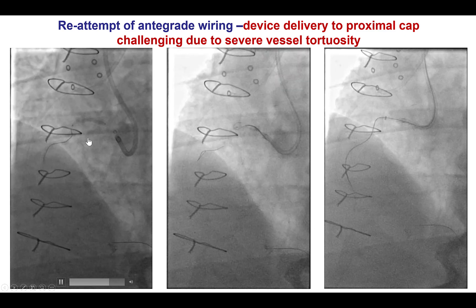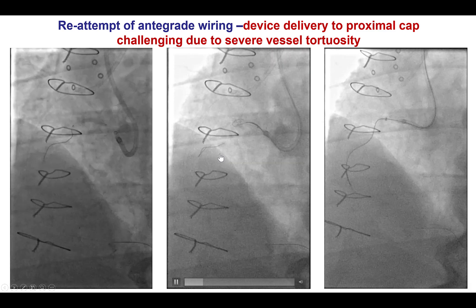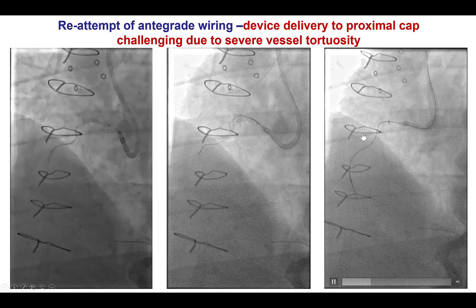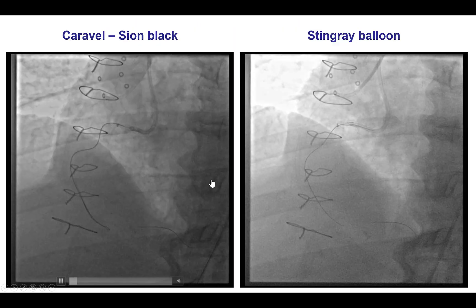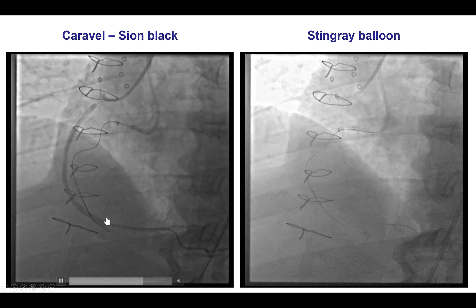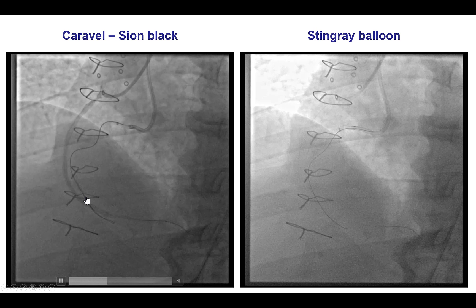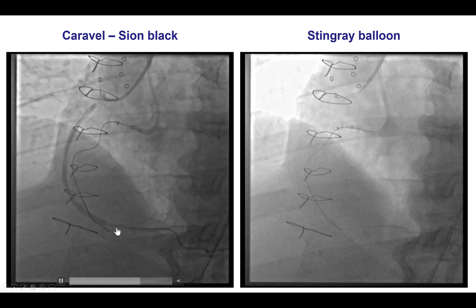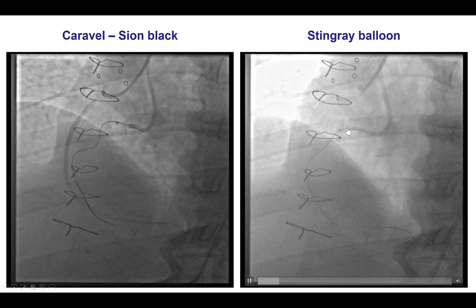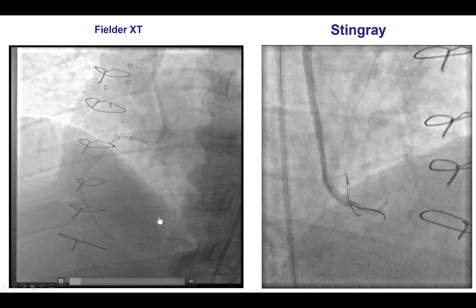So we returned to antegrade crossing attempts. We realized that antegrade wiring would not work and changed to antegrade dissection re-entry using knuckled guide wires. After using a Sion Black polymer-jacketed wire, the wire seemed to advance close to the distal cap — it was actually moving along the side of a branch of the distal right coronary artery. After this, we decided to attempt re-entry by delivering the Stingray balloon.